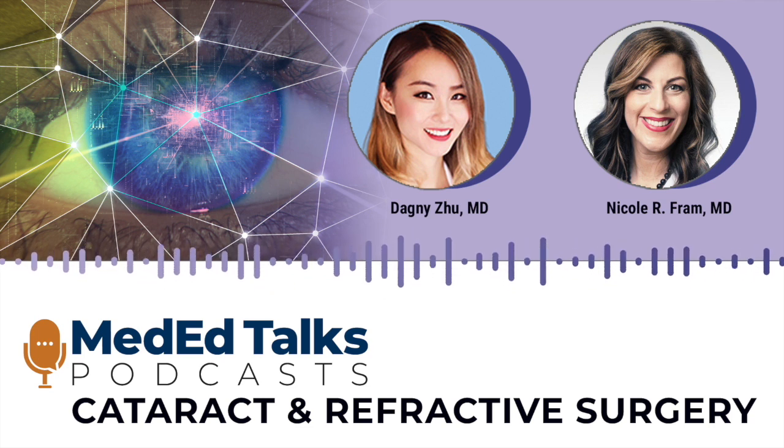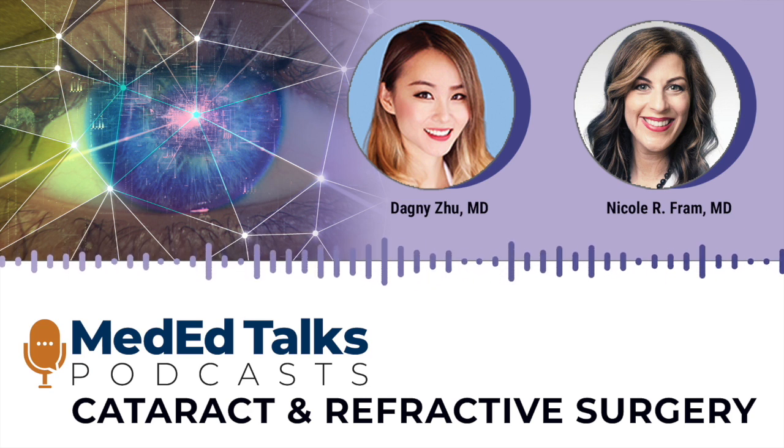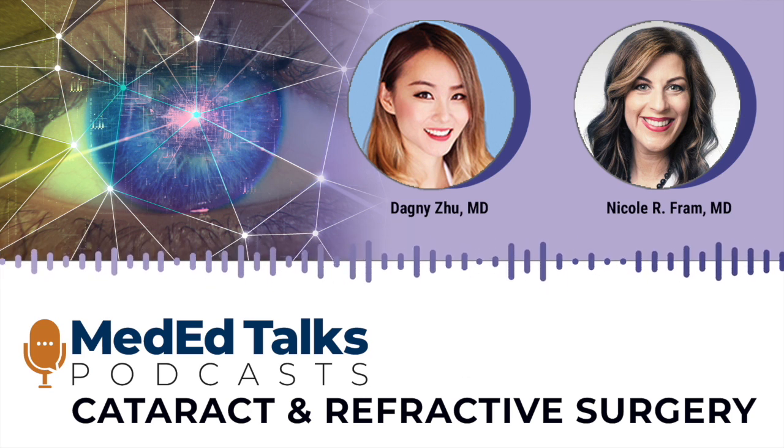So I think we both have on our wish list another intraoperative diagnostic or imaging system, which is intraoperative OCT, which will actually allow us to see, perhaps one day in vivo, in real time, what's going on during surgery. How do you think that will help us with our cataract surgery outcomes?